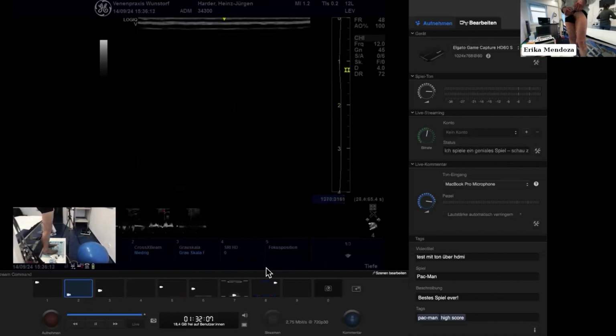So what's your feeling, Joseph? Yes, Professor, I think this is a perfect case for the application of what we refer to as empty vein sclerotherapy. In essence, it entails, firstly, a vascular access. So you need secure access, either via an 18-gauge angiocath or any other. I actually, believe it or not, just use hypodermic needles for vascular access, and I would gladly show you some time. The point is secure vascular access, firstly.